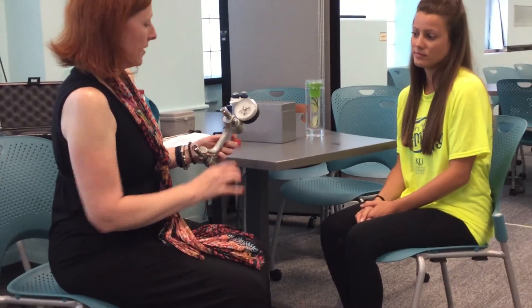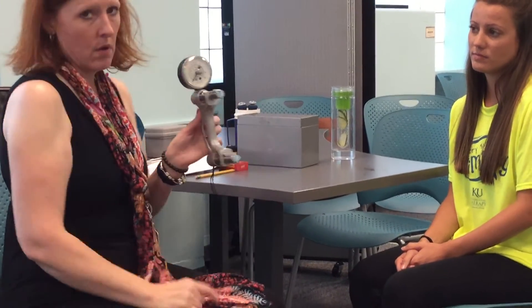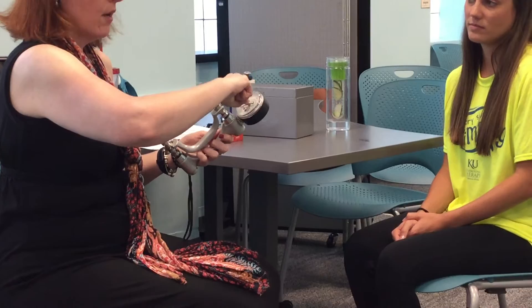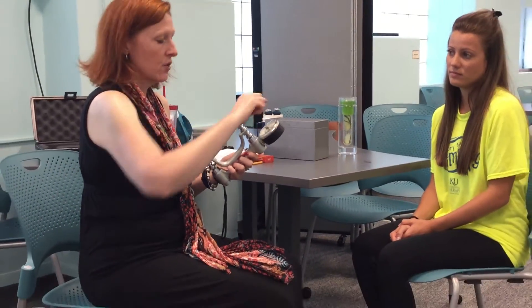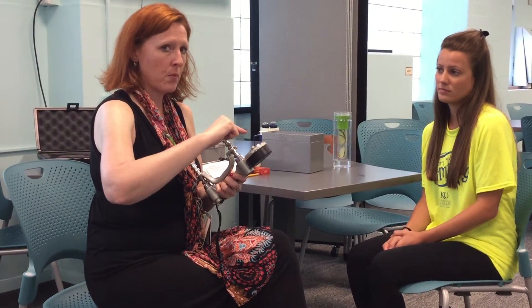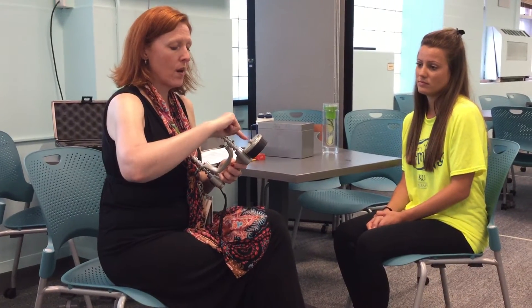Just to let you know the caveats with the dynamometer: you've got two different readings in there, two different number of readings. The outside, the outer ring, is in kilograms; the inner ring is in pounds. When reading this, we typically, for our norm range, have associated it to pounds. So you'll want to always read the inside number and not the outside number.